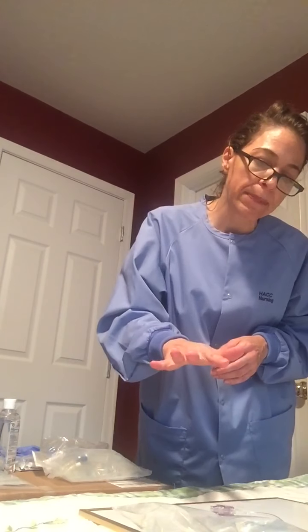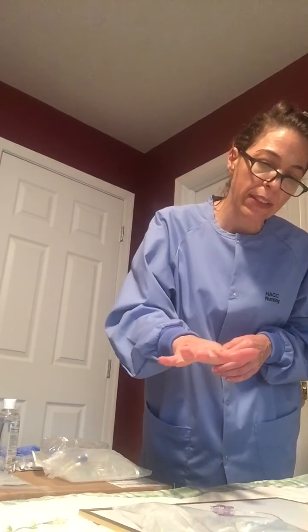I would go over the 6 rights: the right patient, the right medication, the right dose, the right route, the right time. And then I would do my 4th check when I'm documenting, and that would make 4 checks and 6 rights. So first I'm going to check the IV site in the hand.